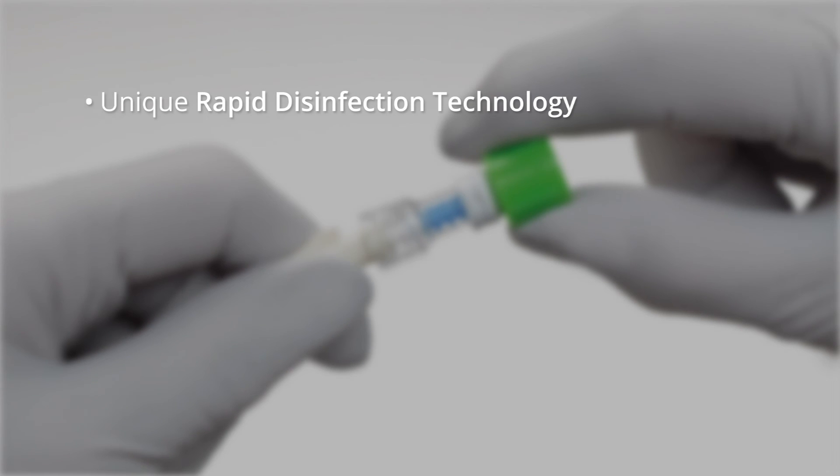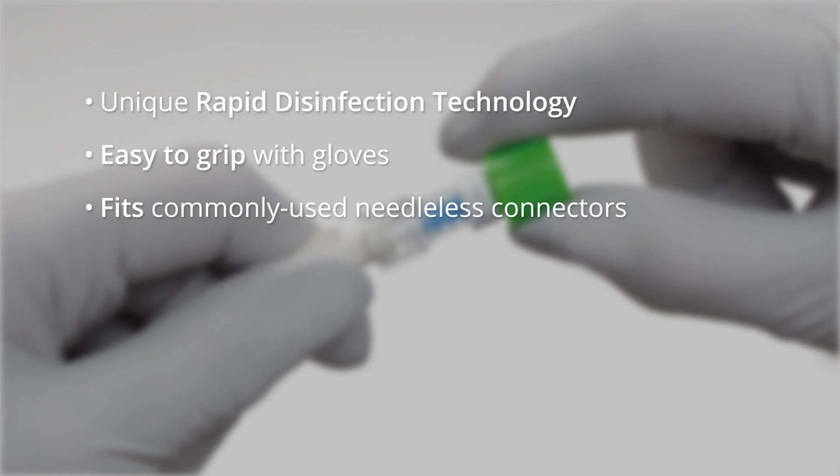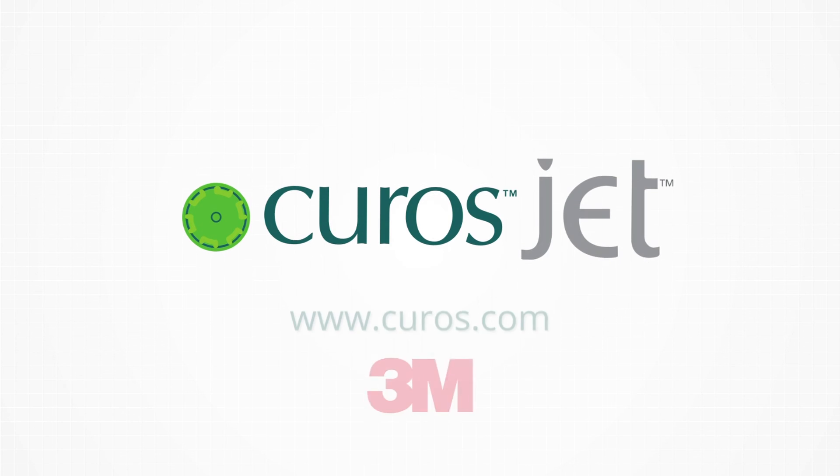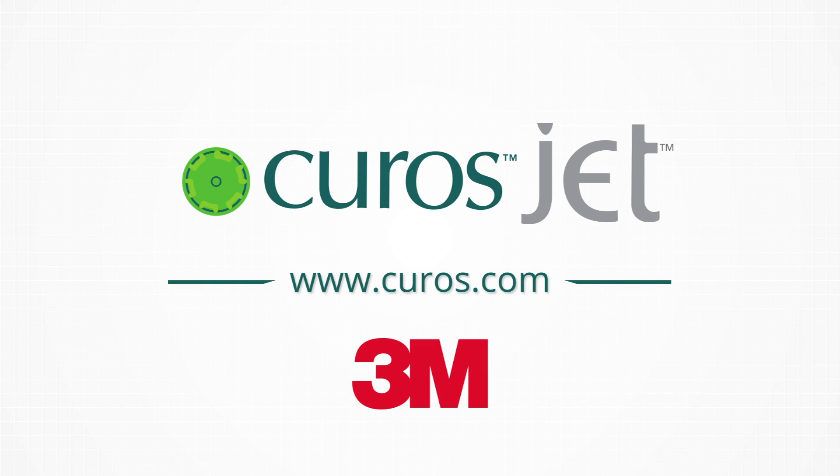Unique rapid disinfection technology. Easy to grip with gloves. Fits commonly used needleless connectors. Convenient bedside strip. Curos Jet Disinfecting Caps from 3M have it covered.